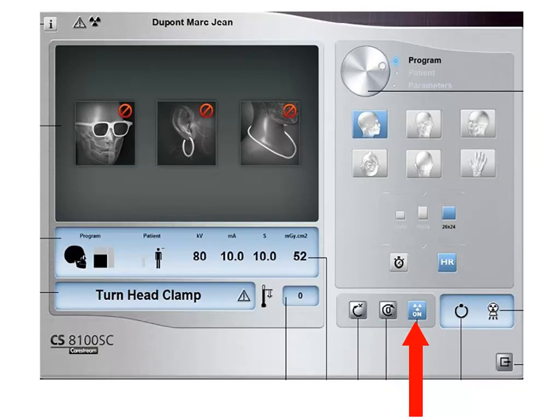X-ray on-off button. Enables or disables X-ray emission. Ready indicator LED. Green indicates the unit is ready to start acquisition. Black indicates the unit is not ready to start acquisition. Exit button. Closes the acquisition interface. X-ray emission indicator. Yellow indicates the X-ray emission status. Selector button. Selects acquisition setting options.